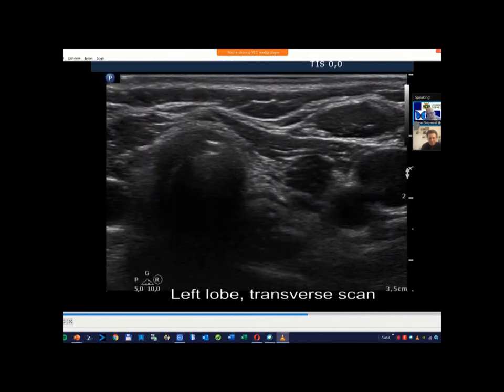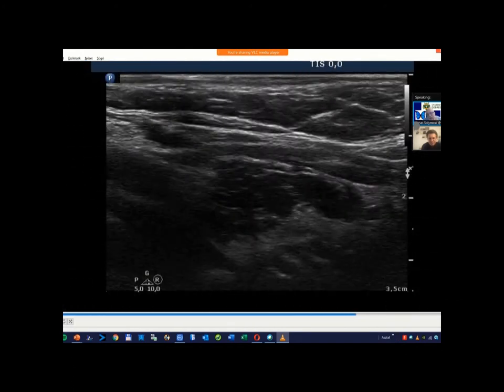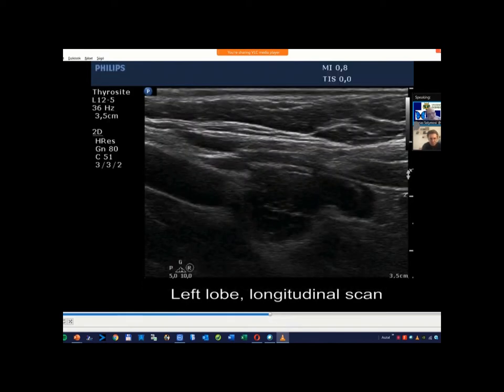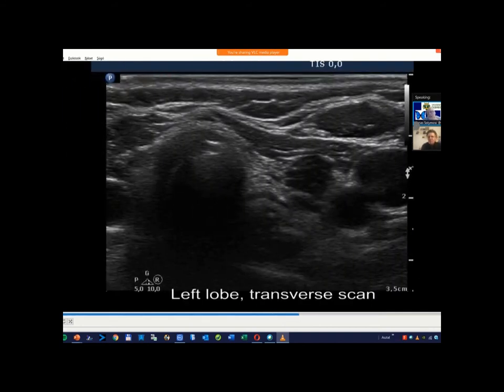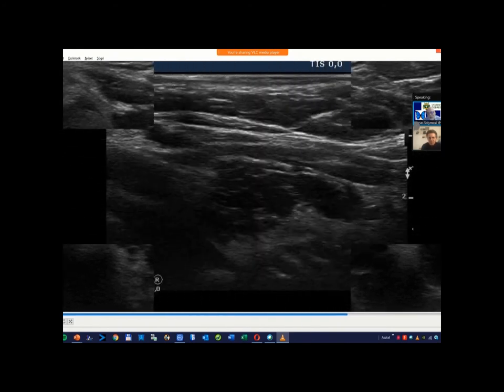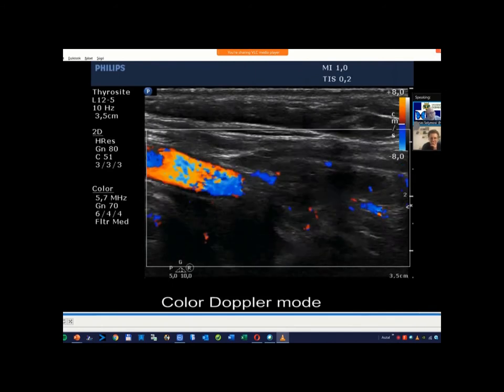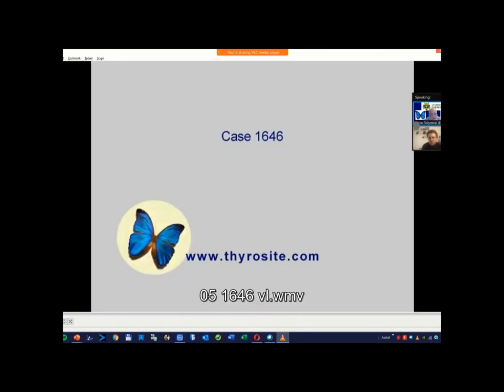So in the event of a follicular proliferation or a follicular tumor diagnosis, it would be worthwhile to reconsider the ultrasound presentation. In cases such as this one presented here, we can exclude a follicular tumor based on the ultrasound pattern. In this situation, the negative predictive value of the vascular pattern can be used to avoid unnecessarily radical surgical procedures.